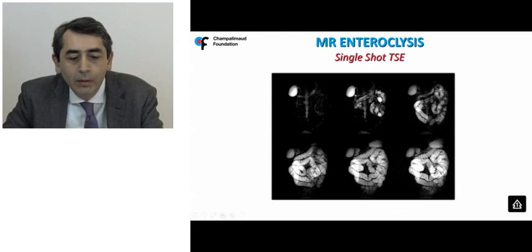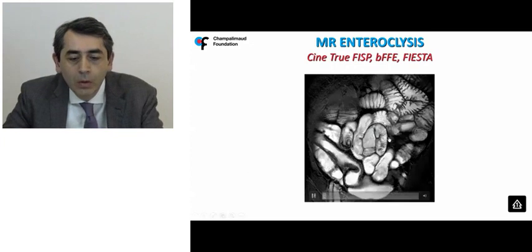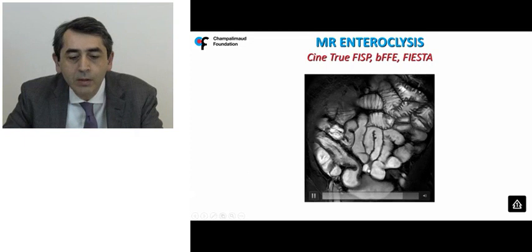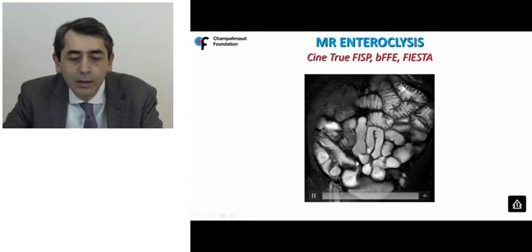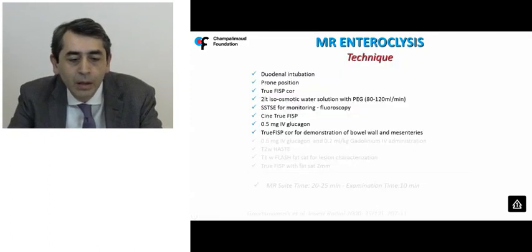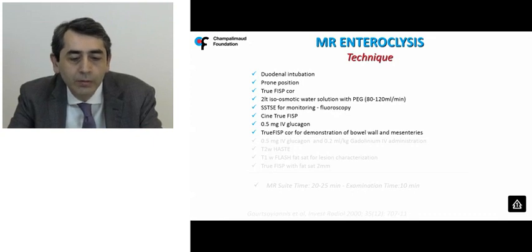As soon as contrast reaches the cecum and terminal ileum, infusion is stopped, and a CINE TruFISP method is applied to study global or local motility patterns. This is very important because it provides information regarding the nature of a stenotic lesion — whether it's a fibrostenotic stricture or a soft inflammatory type of lesion. Following that, the antiperistaltic drug is administered. Glucagon works much better for small bowel, while buscopan is more efficient for large bowel applications.